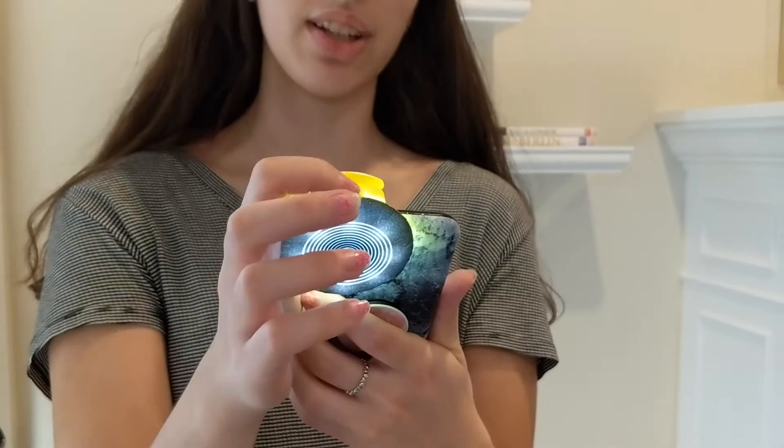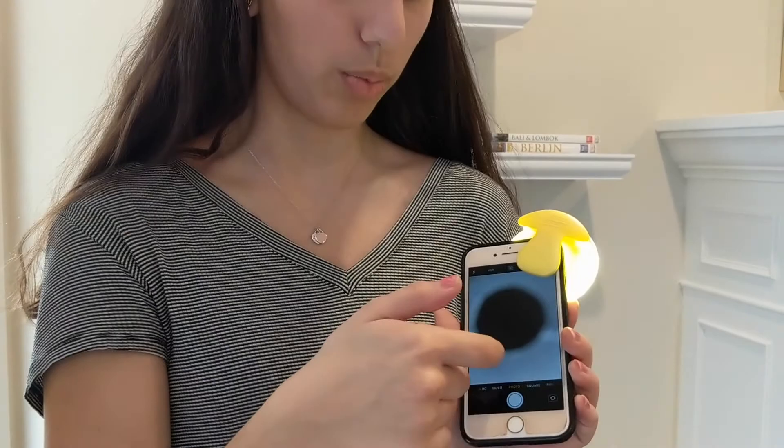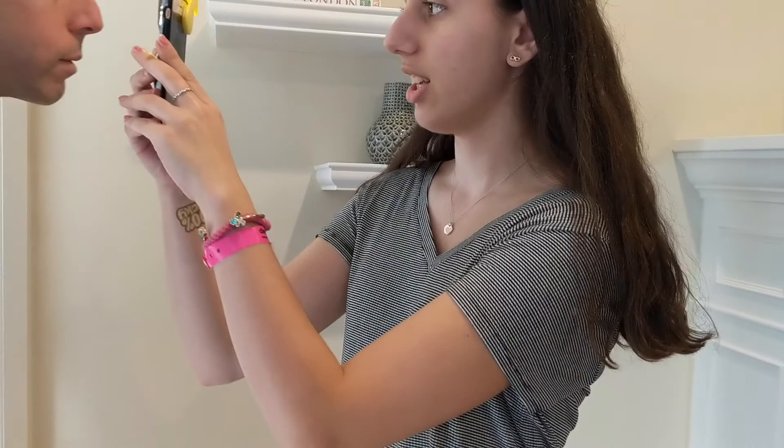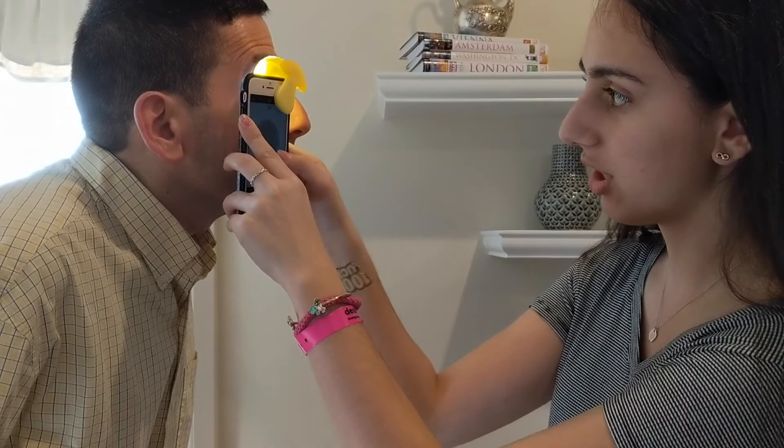Now what I'm going to do on the top is there are two lights. I'm going to turn both on to the brightest, so I click both them three times. So my lights are on, as you can see here, and you can see here because it's all white around what used to be black before. Now I'm going to go up to my subject. This is my dad.